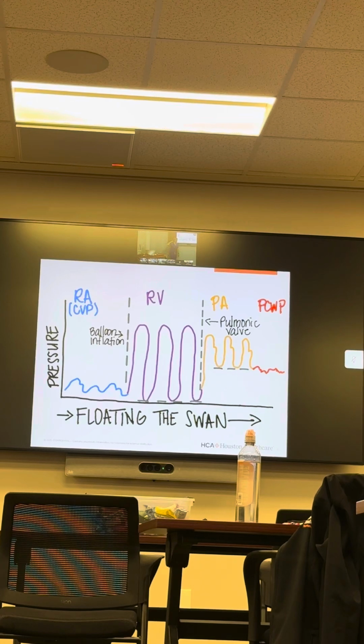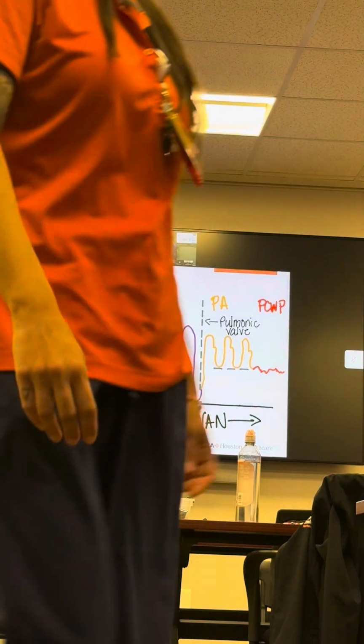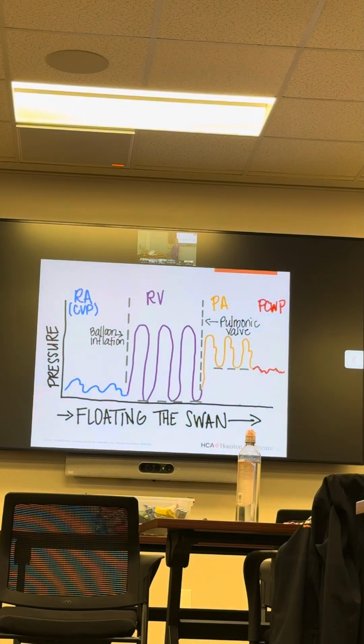So they typically drop a sheath and then they feed this yellow piece in through there. On the monitor, it's not going to look all color-coded and pretty, okay? It's all going to be yellow, but lucky you, you just memorized what a CVP waveform looks like. Good job. And you will see that right atrial waveform show up. I know it's in the right atrium because of that waveform, so it does make sense that you should commit that to memory. And I know because the pressures are pretty low.